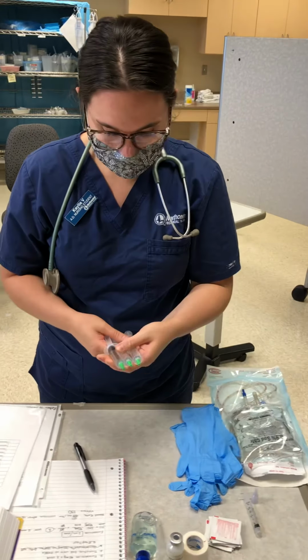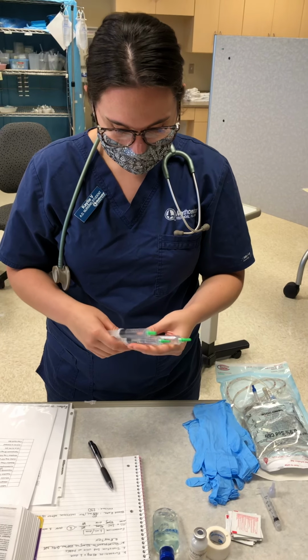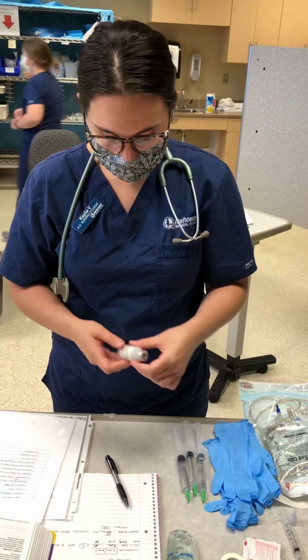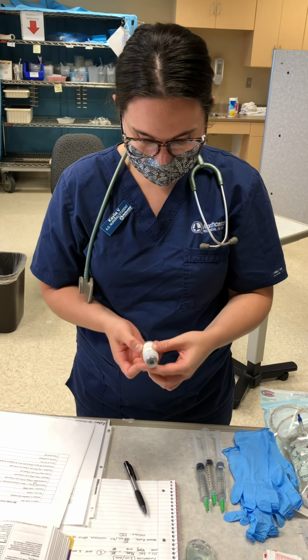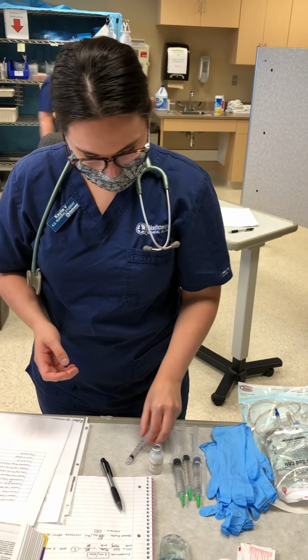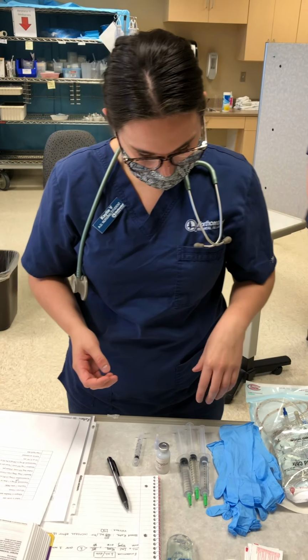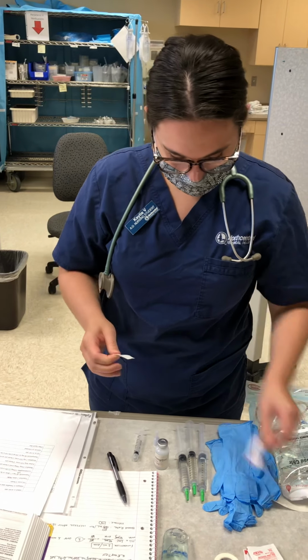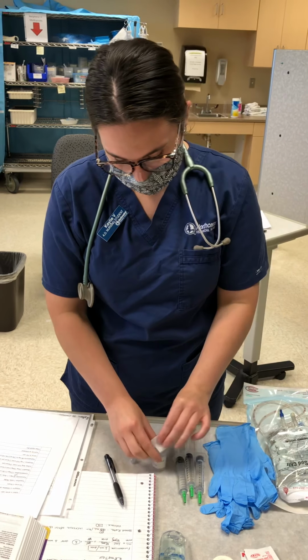I have my 3 syringes. Checking the expiration date. They're all good. I grab my furosemide. Expiration date's good. It's clear. With my syringe and my access device. Perfect. I'm gonna grab an alcohol swab. Clean the top.